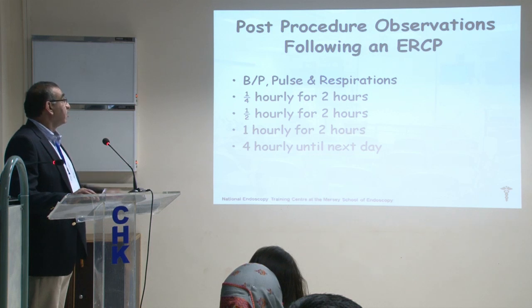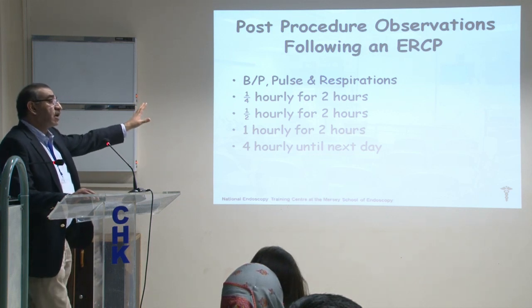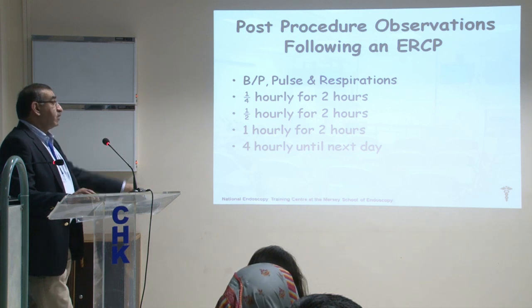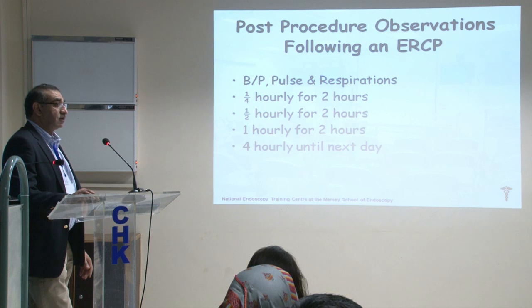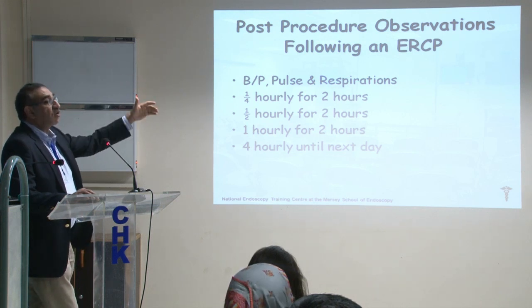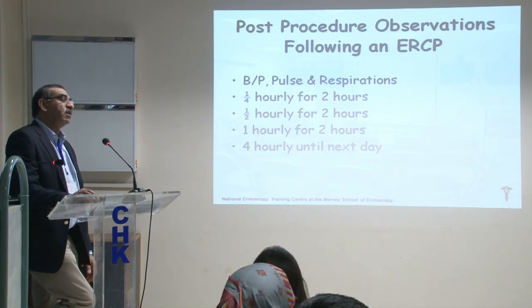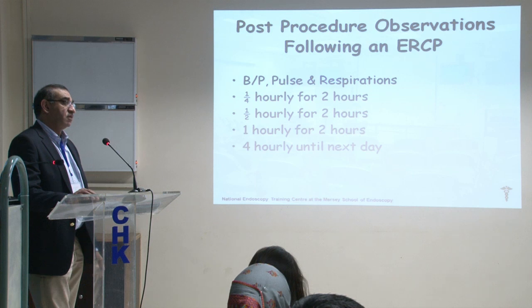If they are not, then normally what happens is, if you do it as an outpatient procedure, they are monitored for 4 to 6 hours in the recovery unit of endoscopy. What's the evidence for that? The evidence was the NCEPOD study. But that's telling you 7-day or 30-day mortality. No, it was a detailed audit study, so there was a lot of information. How long ago? That was about 2004 or 2005. It was quite extensive, done over 4,000 to 5,000 patients.